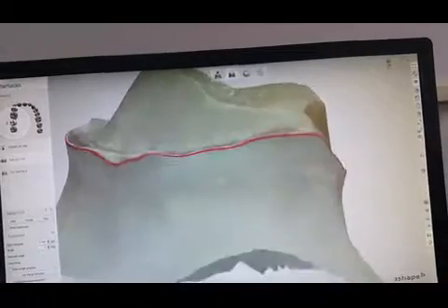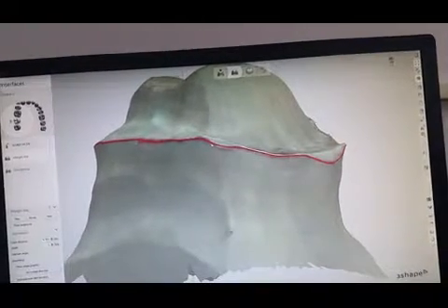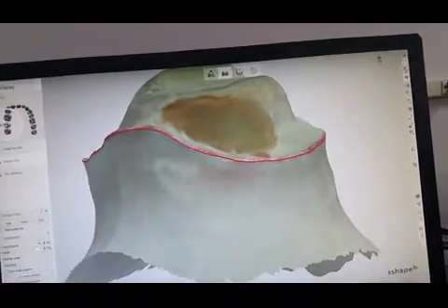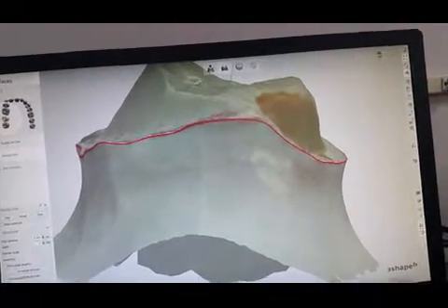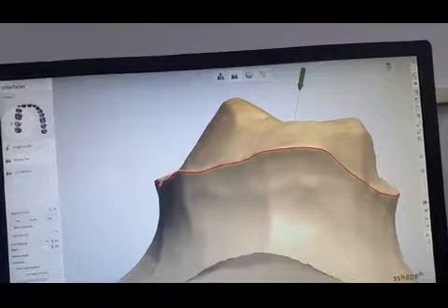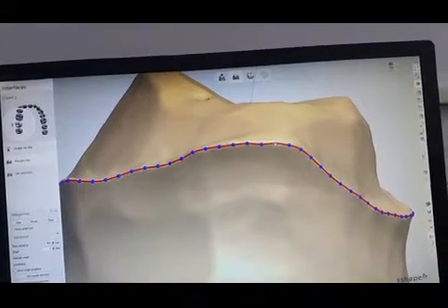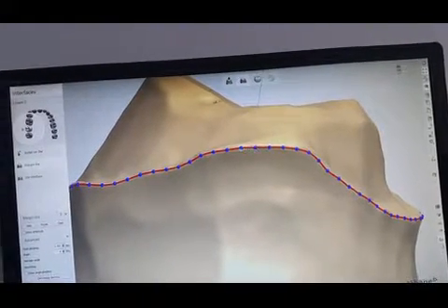One is I can just do a fast, quick pickup on it, which is I can draw like this, which sometimes I use for crystal clear margins. And if I have any spot where I think there is a discrepancy or I'm not sure exactly where it goes, I go to this mode and it gives me a little bit clearer image on the sharp edges on the margin. And I go into this dot mode and I can push it up and down on a very particular precise area as such.